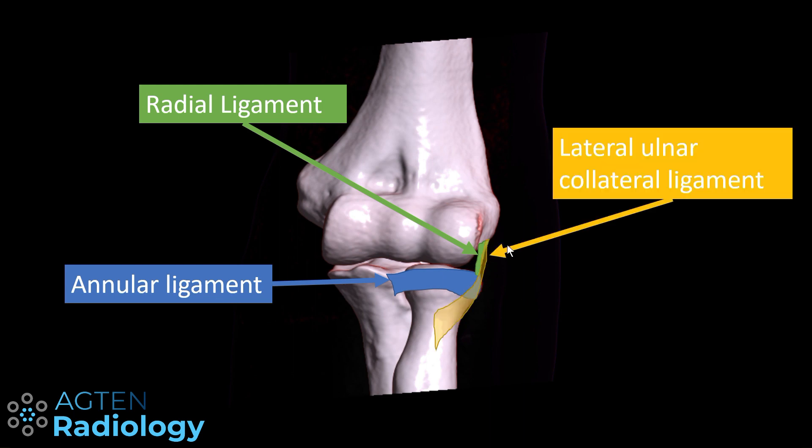Behind the radial ligament, so posteriorly, lies the origin of the lateral ulnar collateral ligament, also known as the LUCL. It runs distally, blending together with parts of the annular ligament, and then running around the radial neck inserting onto the supinator crest. Some authors describe a fan-shaped portion which inserts more proximally onto the supinator crest, with a thicker band inserting down onto the tubercle.